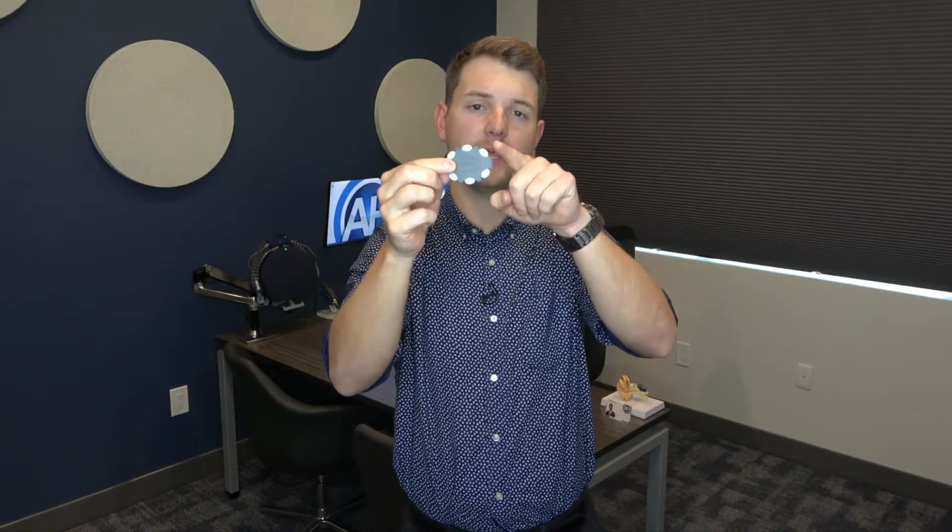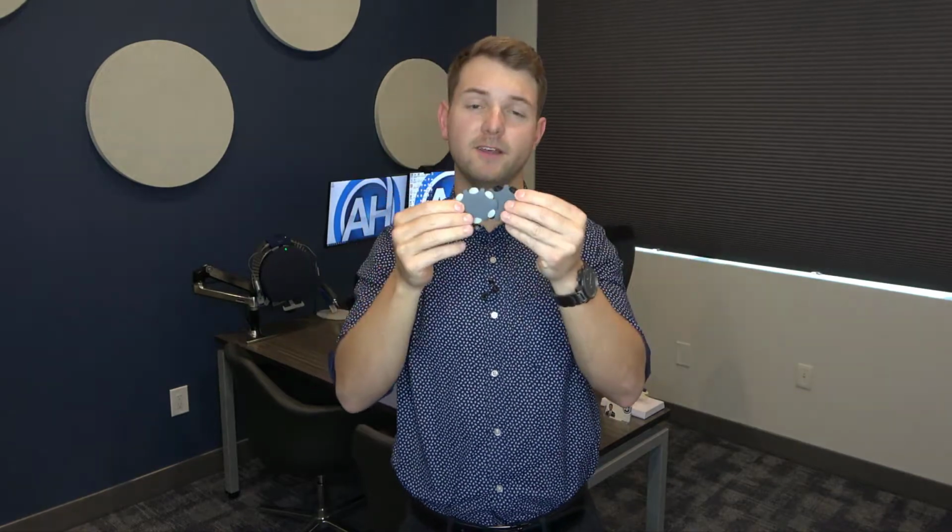The original Pro Wax wax guard is just a little bit larger than the Pro Wax Mini Fit wax guard, but these wax guards were used with devices that came out before the Open line of devices, but they're still being used in Oticon's hard acrylic ear molds for their receiver in the canal hearing aids. One simple way to differentiate between the Pro Wax and the Pro Wax Mini Fit wax guards is to look at the color of the plastic picks along the outside of the wax guard pack. The Pro Wax original is gray. They have gray little picks along the outside of this pack, while the Pro Wax Mini Fit is black.